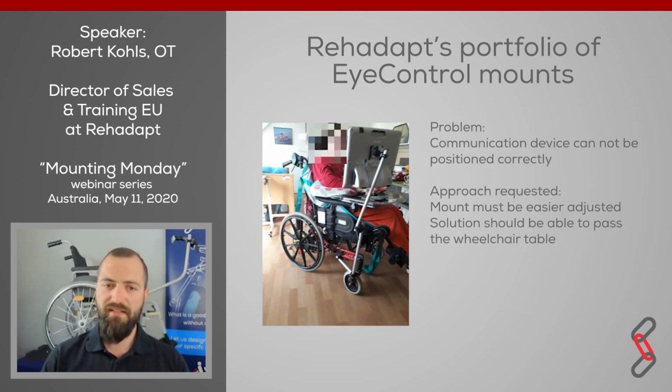This is another very interesting user scenario. We have been requested from a customer. This is someone using a very heavy i15 in combination with that wheelchair. And as you can see here, the tube length is extremely long. The first tube is in a very, very low position. The angle for the first tube goes outside. That could have a negative influence in getting through doors, because there is always a constant risk that the first tube and the mount will get in touch with the door frame, for example.